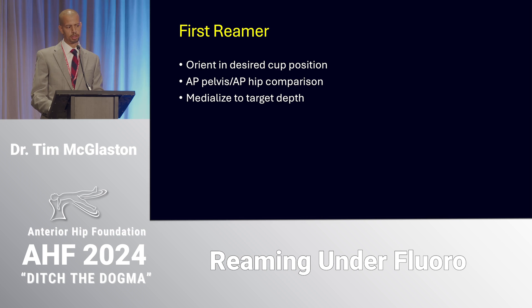For my first reamer, I like to hold it in the desired position for my final cup — generally aiming for about 15 to 20 degrees of antiversion and about 40 degrees of abduction. I put the AP pelvis on the right screen on the fluoro, then bring the fluoro into an AP of the hip on mag. When I move from AP pelvis to AP hip, the abduction angle appears to increase slightly — not more than five degrees — but I like having that feedback prior to reaming. My goal with the first reamer is to medialize to my target depth while considering where the hip center of rotation will end up.